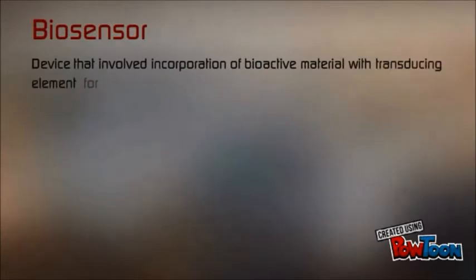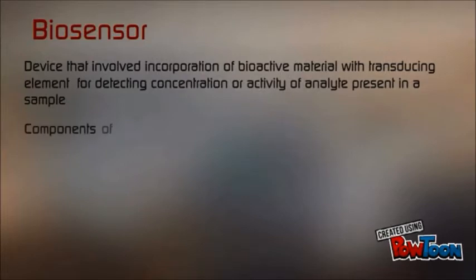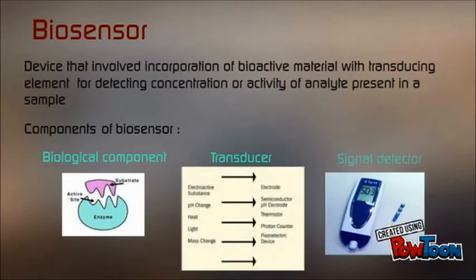So what is a biosensor? A biosensor is a device that involves incorporation of bioactive material with a transducing element for detecting the concentration or activity of an analyte present in the sample. Components of a biosensor consist of a biological component, a transducer, and a signal detector.